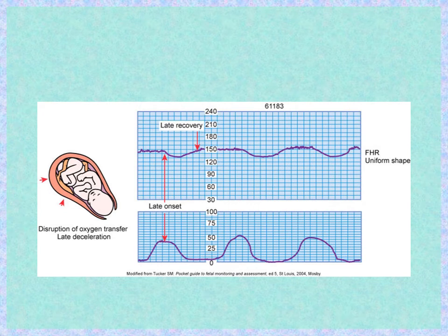Late decelerations begin after the contraction has begun and do not return to baseline until after the contraction is over. The onset to the lowest points is greater than or equal to 30 seconds.